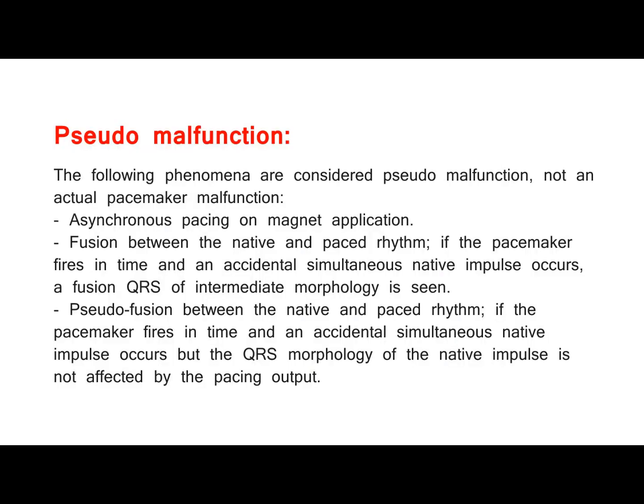Pseudo-malfunction. The following phenomena are considered pseudo-malfunction, not an actual pacemaker malfunction. Asynchronous pacing on magnet application. Fusion between the native and paced rhythm. If the pacemaker fires in time and an accidental simultaneous native impulse occurs, a fusion QRS of intermediate morphology is seen. Pseudo-fusion between the native and paced rhythm.